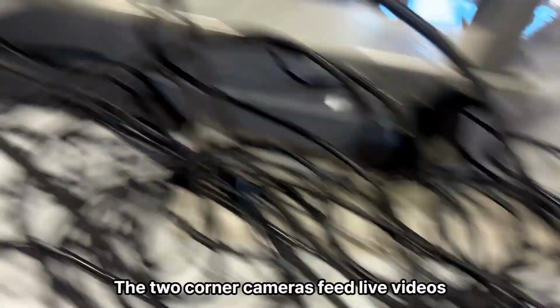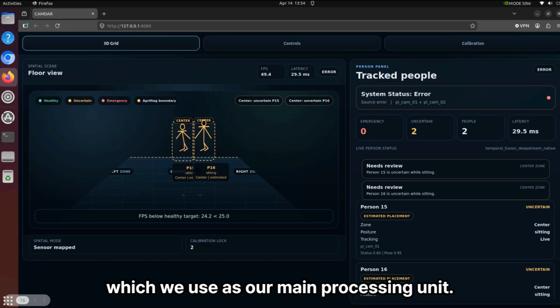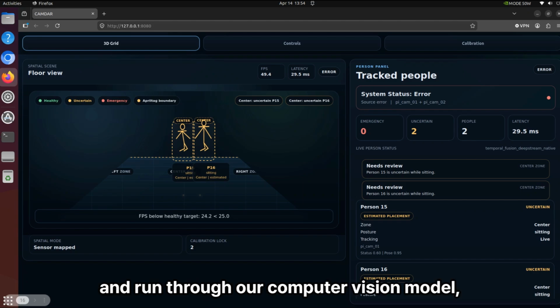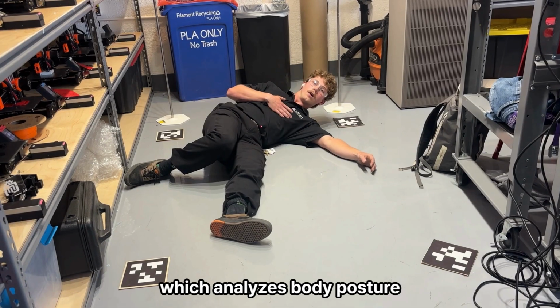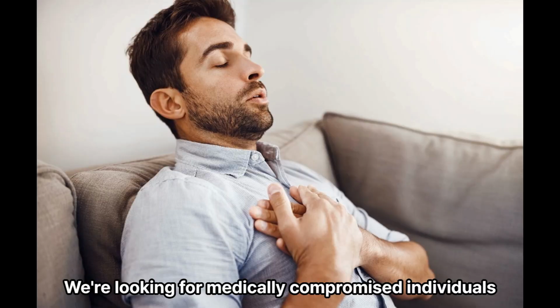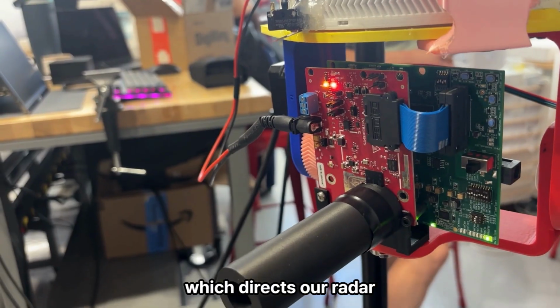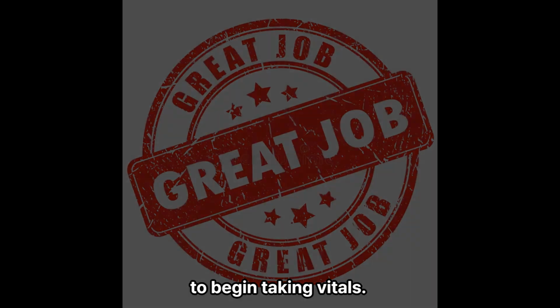The two corner cameras feed live video to our Jetson, which we use as our main processing unit. Images are decoded and run through our computer vision model, which analyzes body posture to determine health status. We're looking for medically compromised individuals, which trigger a detection. This then sends a signal to our altitude azimuth mount, which directs our radar to begin taking vitals.